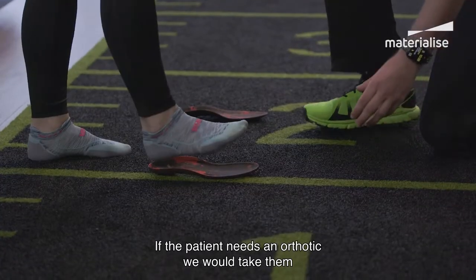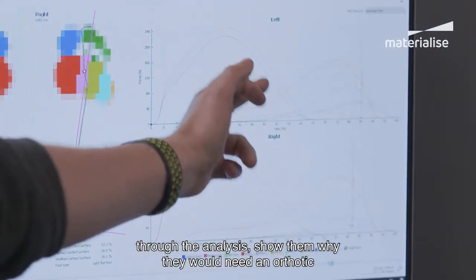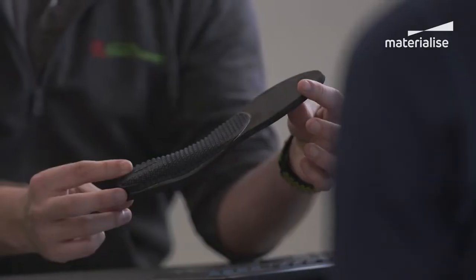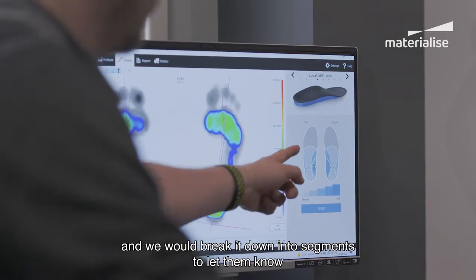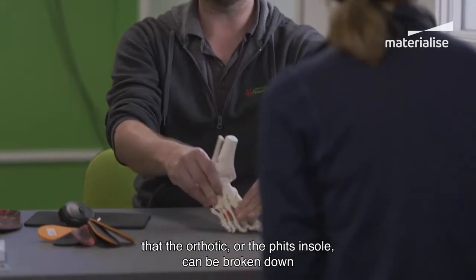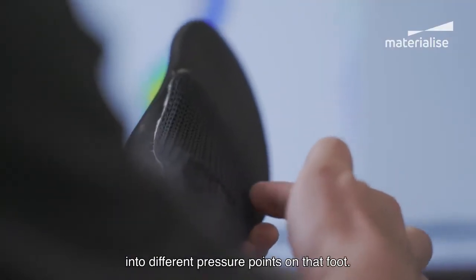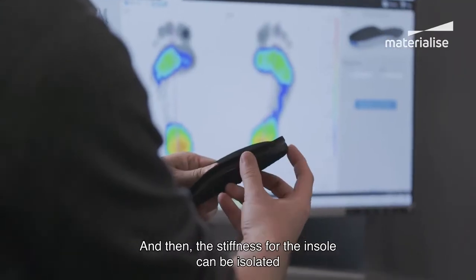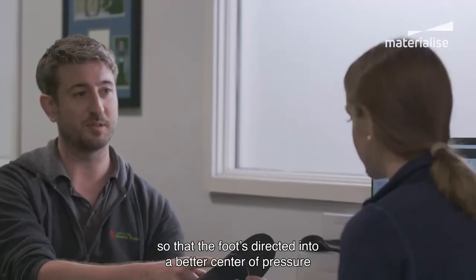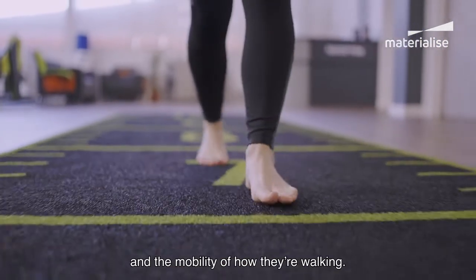If the patient needs an orthotic, we would take them through the analysis and show them why they would need an orthotic or why they would benefit from one. We break it down into segments to let them know that the orthotic — the fits insole — can be broken down into different pressure points on their foot. The stiffness through the insole can be isolated so that the foot is directed into a better centre of pressure, which would improve their gait and mobility.